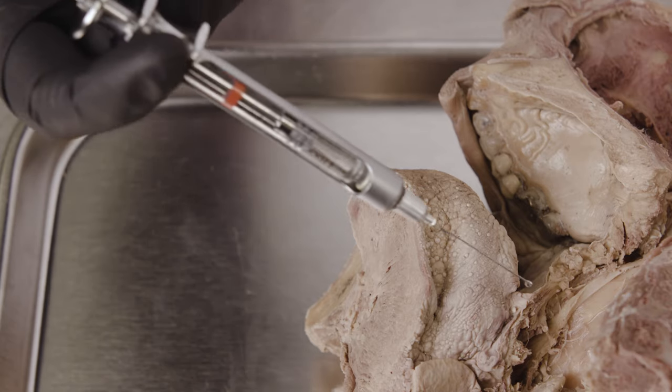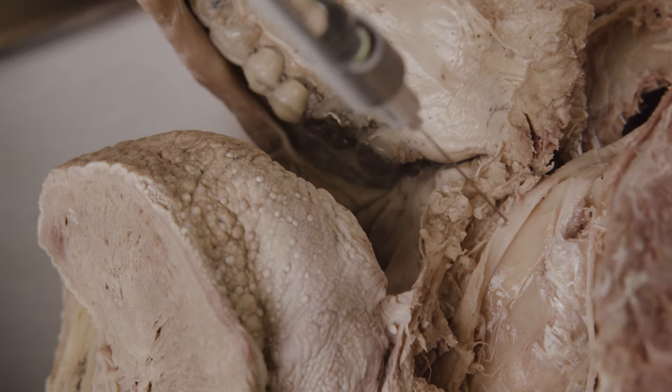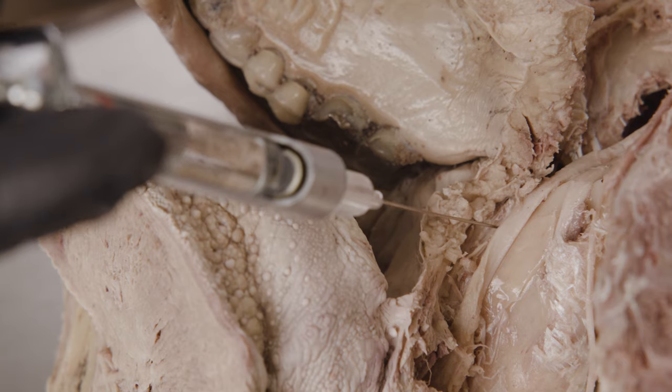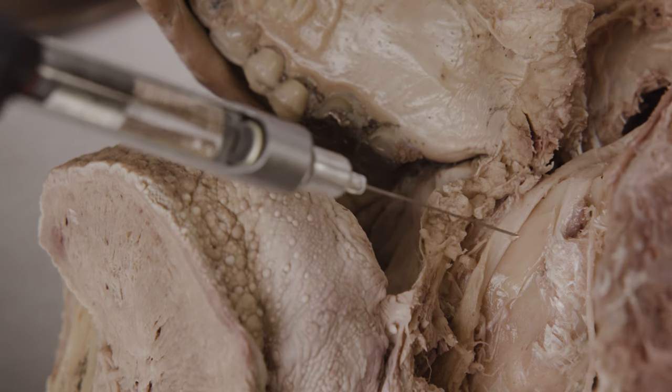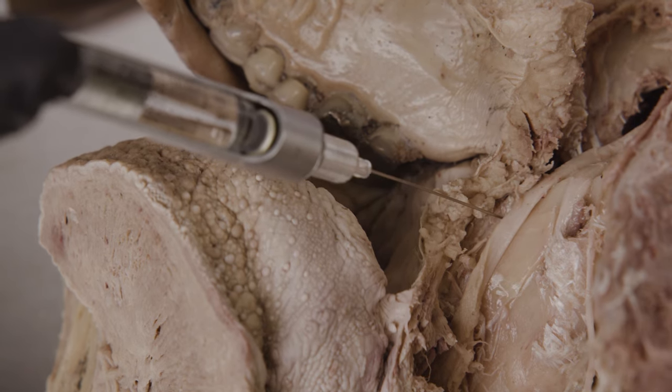You've just been shown how to give this injection correctly. Now watch some of the errors that can occur. The most common error is injecting too low, below the lingula. To aim for the lingula, the needle will be 6 to 10 millimeters above the occlusal plane. You can also inject the needle too far anteriorly or too far posteriorly. Remember, the needle will penetrate the mucosa two-thirds to three-quarters of the way to contact bone. Any less than that, and you're too far anteriorly.